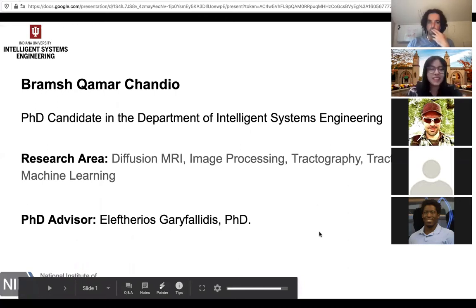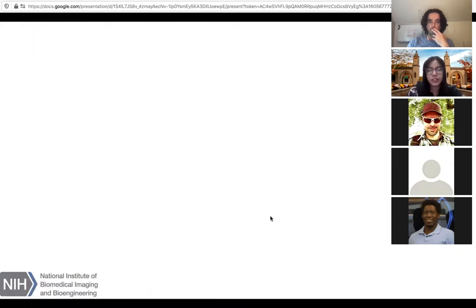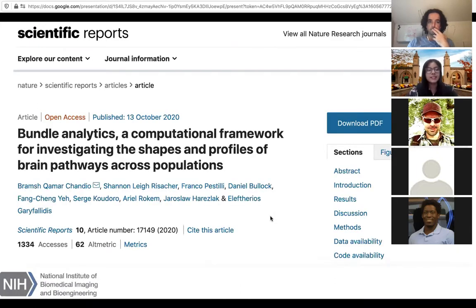Hi everyone, I'm Bramsh Chandio. I'm a PhD candidate in the Department of Intelligent System Engineering at Indiana University. And today I'll be talking about bundle analytics.